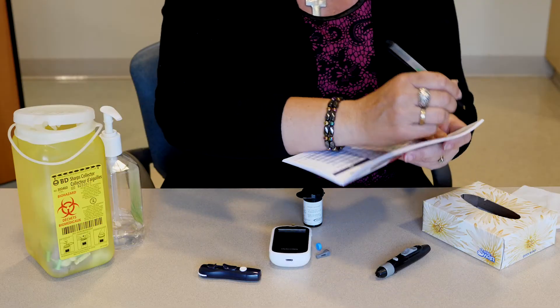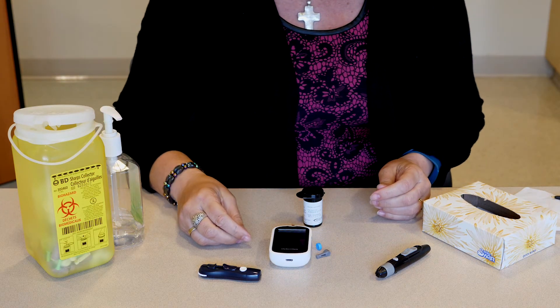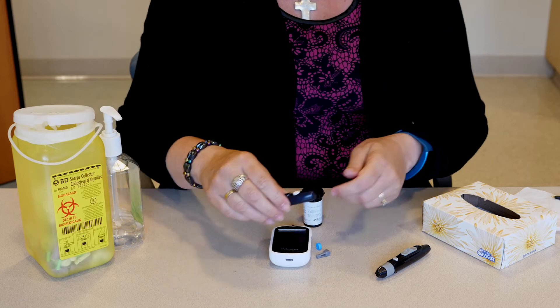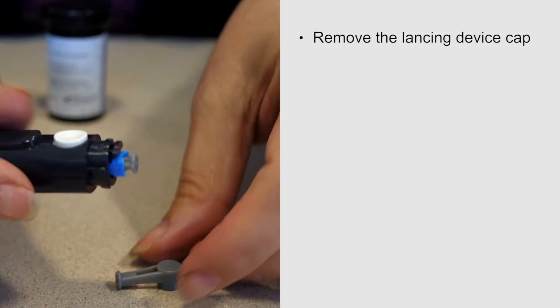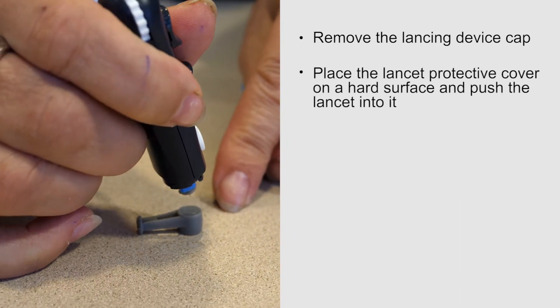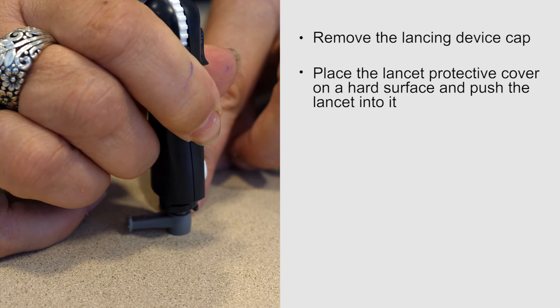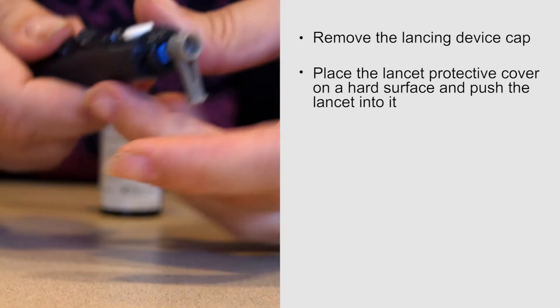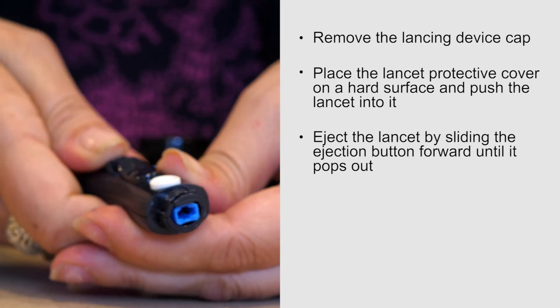You have now completed the blood sugar test. To remove the lancet from your device, remove the lancing device cap, place the lancet protective cover on a hard surface, and push the lancet into it.